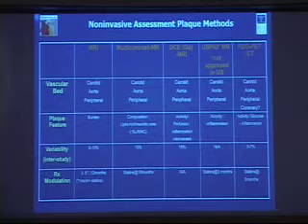And with some modeling, as I will show you a little bit, we can get the aspect of what is perfusing that tissue. So neovascularization, which is an important aspect of, let's say, plaque instability, but could also be important in the AAA, obviously. The measurement here is difficult. This is where we need better computational tools, and people develop different models, et cetera. I will show you work from a PhD student in our lab, a very simple area under the curve measurement, shown in a recent study to have a good relationship for neovasculature.